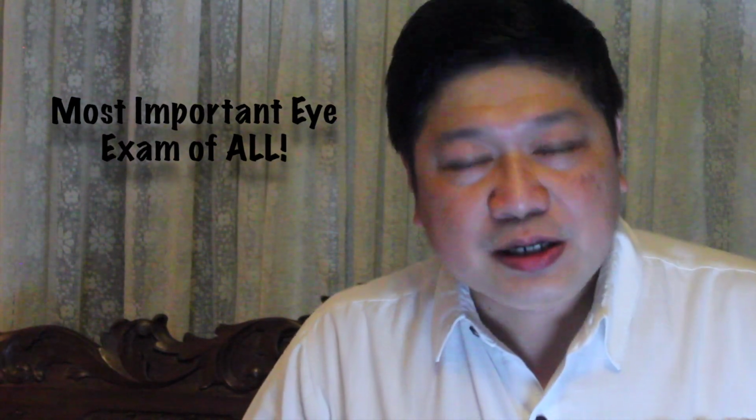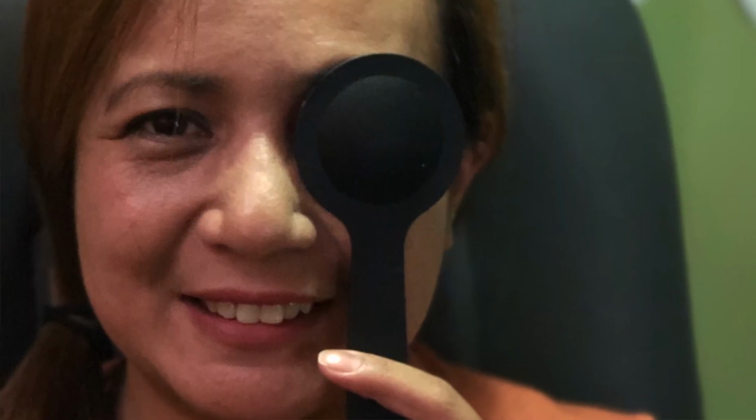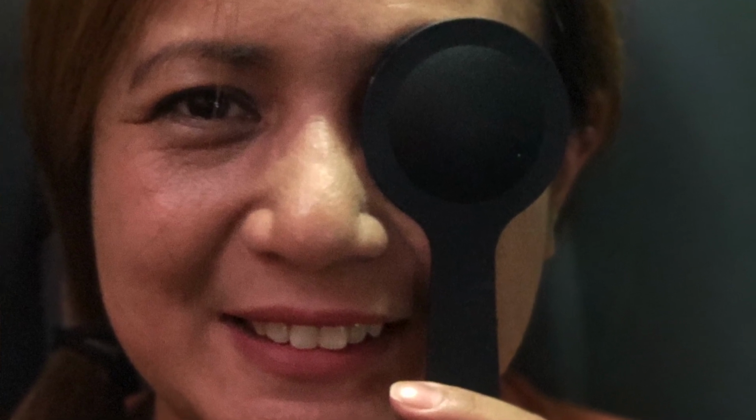Testing visual acuity is the most important eye exam of them all, and in the next few minutes I will teach you how to perform it properly. I will teach you which of the particular options of this exam is usable for your particular situation, and I will guide you step by step on how to perform this exam.